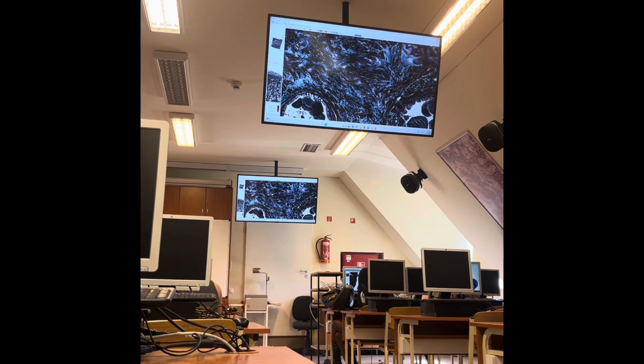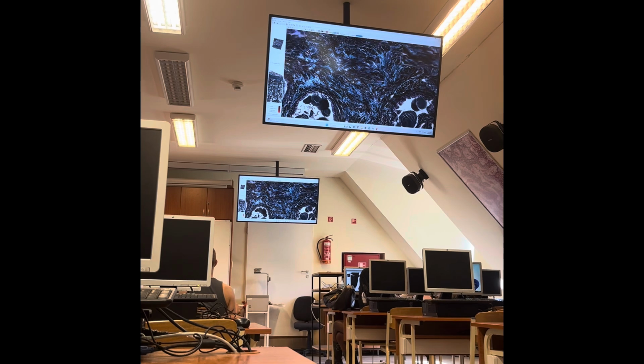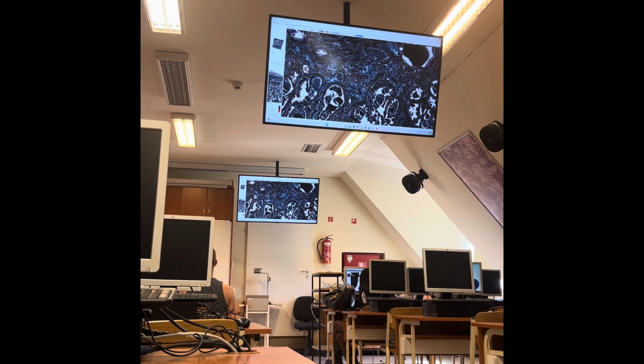As far as I know, it's mostly collagen fibers. We cannot exclude that in low amount there can be some reticular fibers or maybe some elastic fibers, but obviously the majority of the fibers are collagen fibers. Is the space around the concretion biological or not?